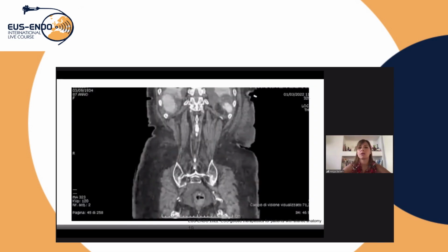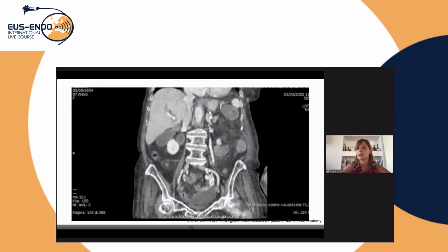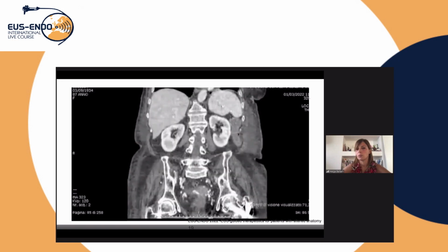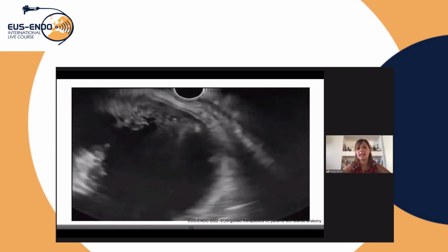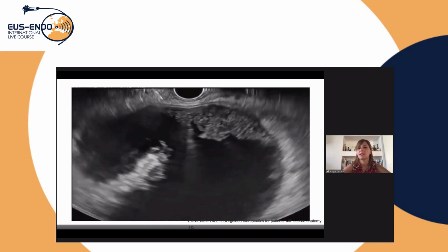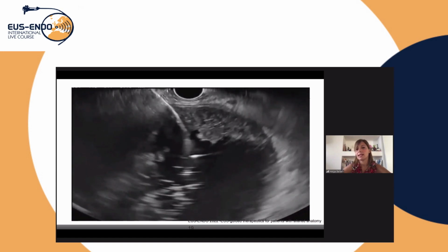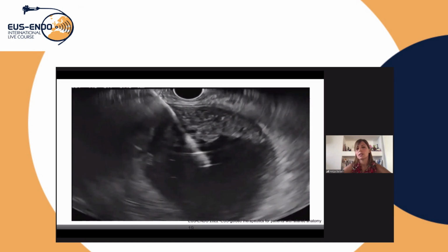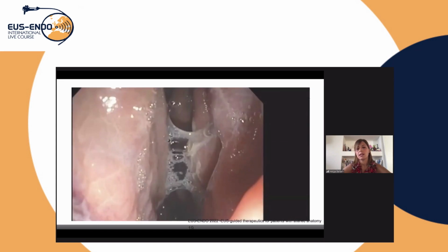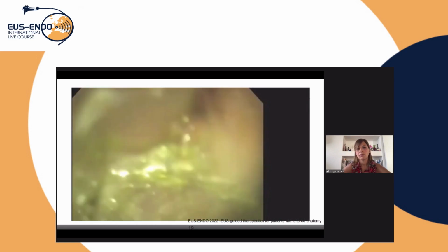And this is one of the cases in which the patient had a recurrence of a pancreatic cancer after pancreaticoduodenectomy. You can see how dilated the afferent jejunal loop is. And under EUS, from the gastric or the jejunal limb, you can see the very dilated limb without the need of injection. And you can release the LAMS under EUS vision, anchoring to the stomach wall, and let the bile and pancreatic juice fill the stomach.